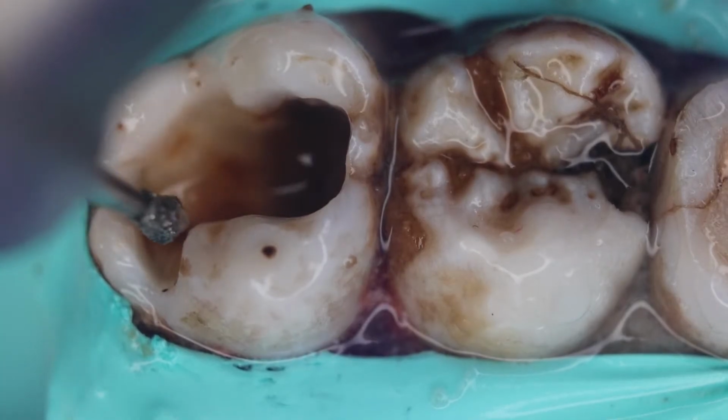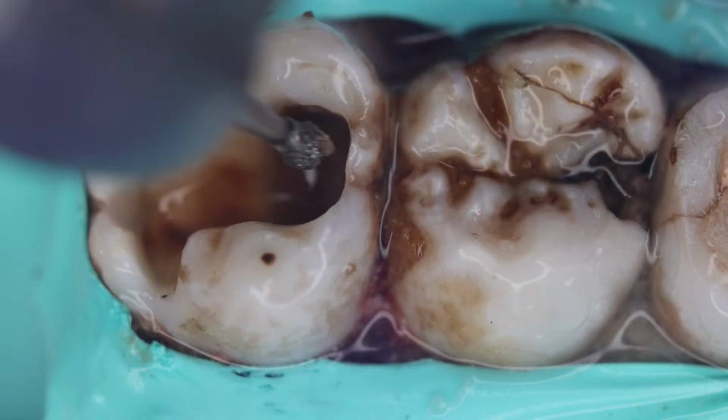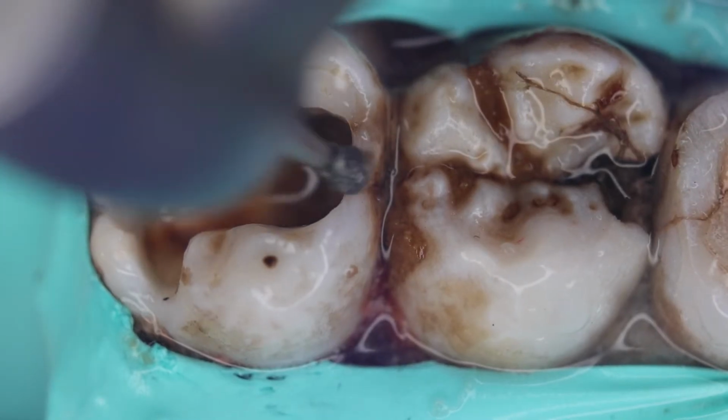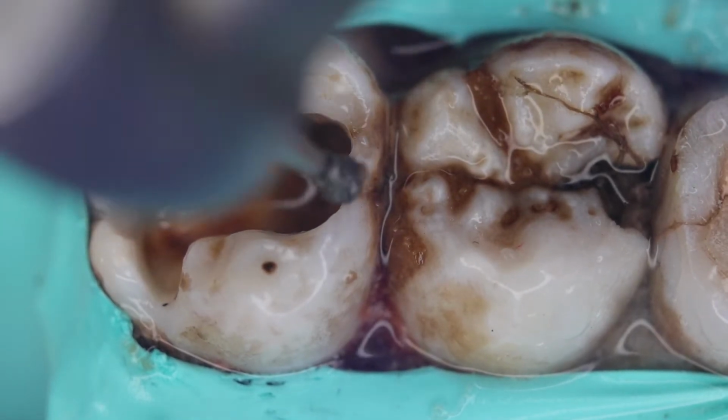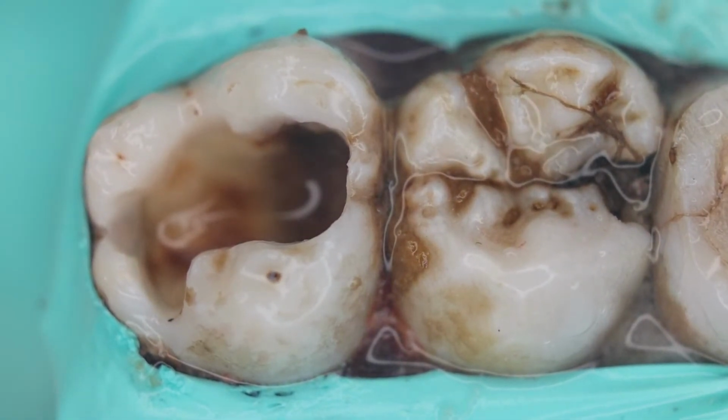We have the rounded angles over here, and if there is any caries that you may find, you can use the round burr and remove the caries that is left behind once you have formed the cavity.